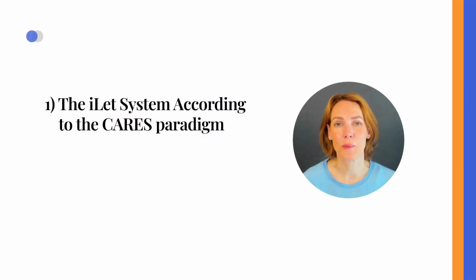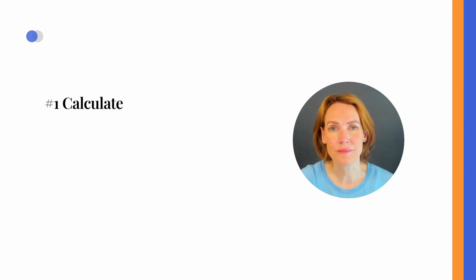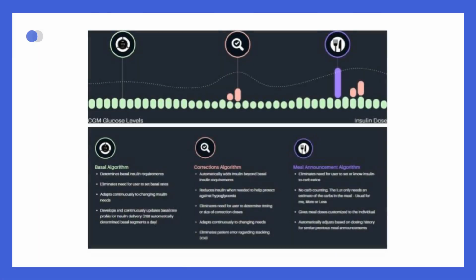1. The iLet system according to the CARES paradigm. 1. Calculate. The iLet system automates all insulin delivery and it only needs the user's weight to begin. The iLet system operates through three concurrent algorithms.